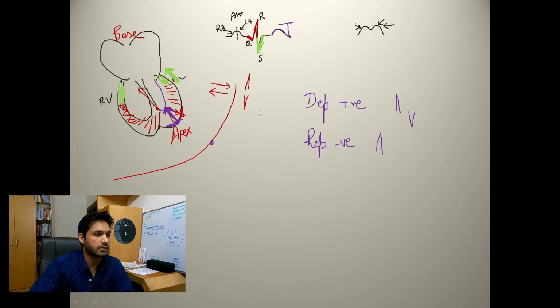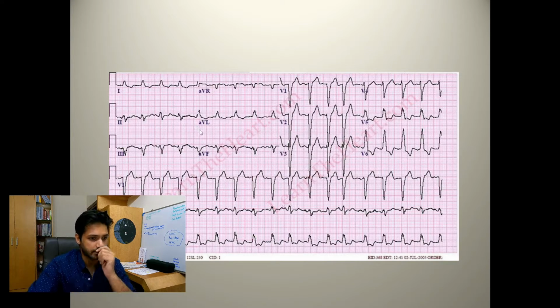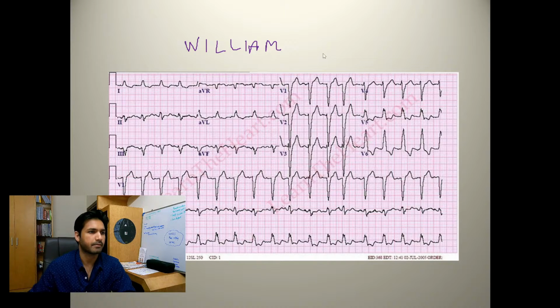Okay, now that we have that out of the way, I want to talk about left bundle branch blocks and right bundle branch blocks. I don't want to go into too much detail, like I said. Remember this mnemonic, William, Marrow.